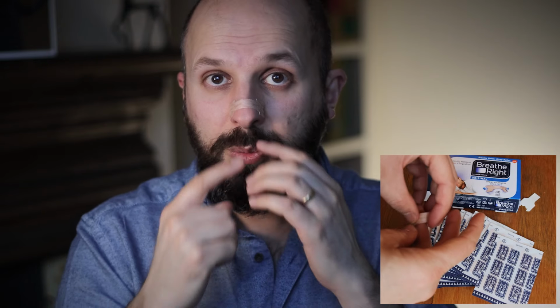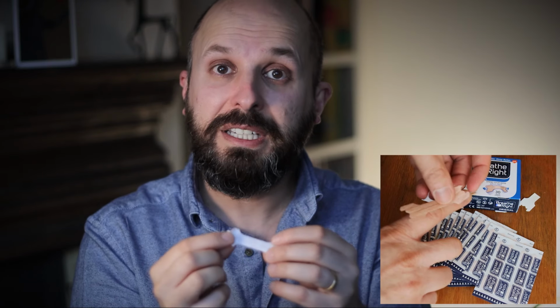So if you're prone to nosebleeds, for example, this would be a good one because it's nothing going up into your nose. The other problem with these strips is that you could be slightly allergic to the glue here. Some people wake up with a bit of redness across here. Sometimes if you use it for a long time, you get a little bit of a red mark across here because it's pressing on your nose, and they can cause some skin irritation to the bridge of your nose.